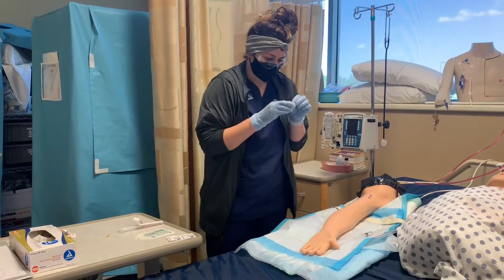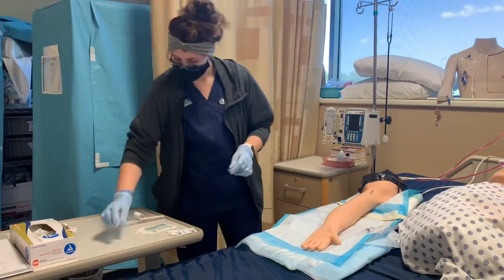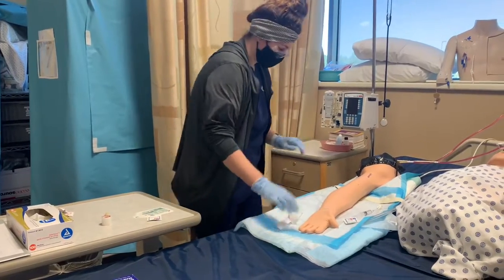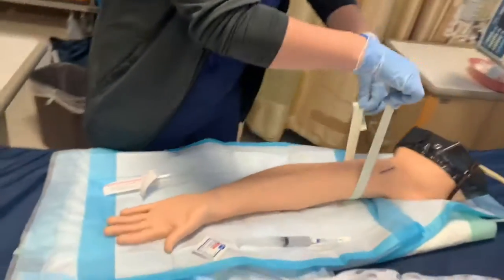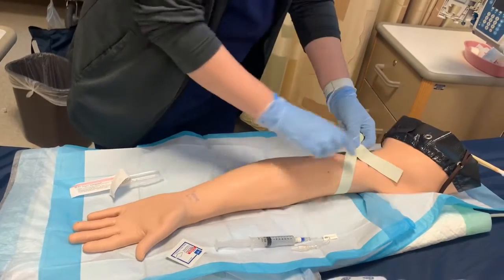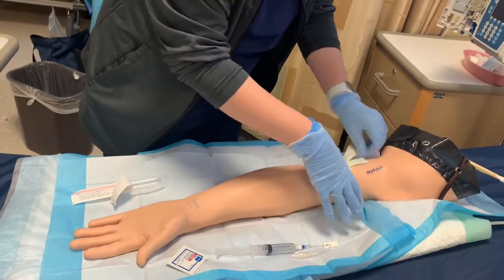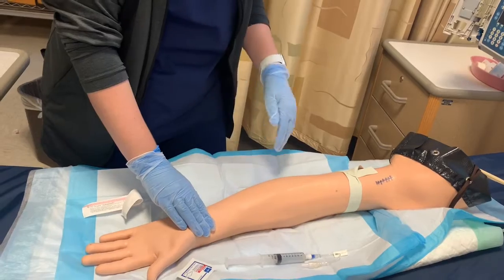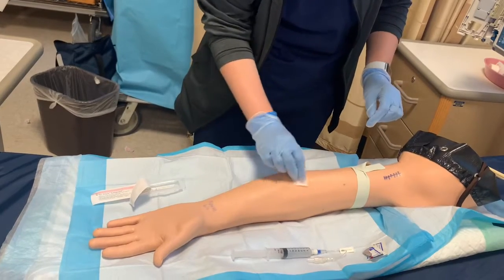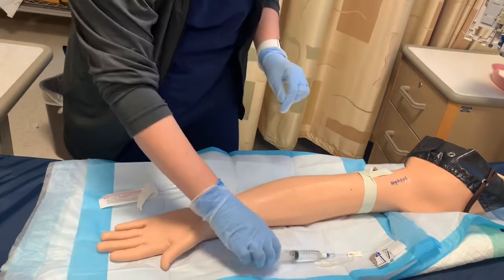Okay, I'm going to get my piece of tape ready. Got my alcohol and my needle. Okay, Ms. Jones, I'm going to apply the tourniquet so we can find a good vein. I'm going to make sure to go 15 to 20 centimeters above the vein that I want to use. Make sure this is good and tight, but not too tight. I'm going to check the pulses, make sure we got good blood flow, and it's good. So now I'm going to clean the site in a circular motion with an alcohol pad. Okay, dispose of that. We are all set.